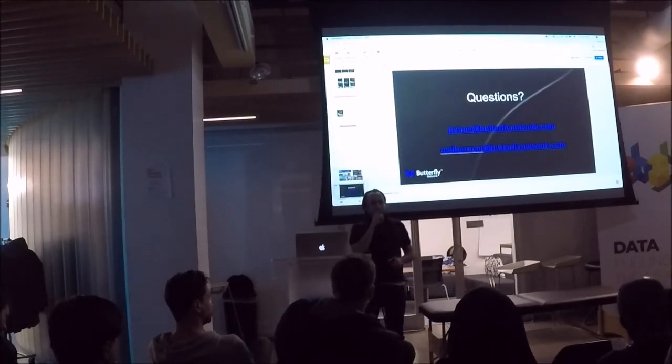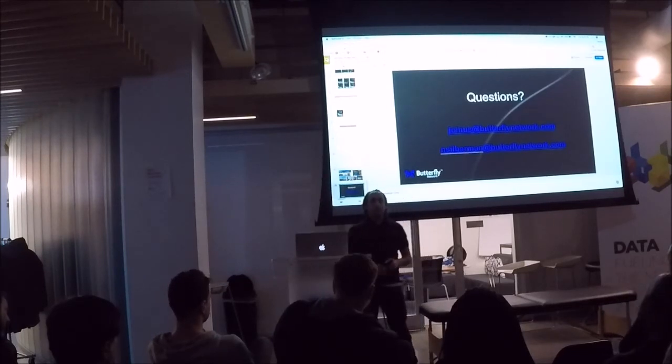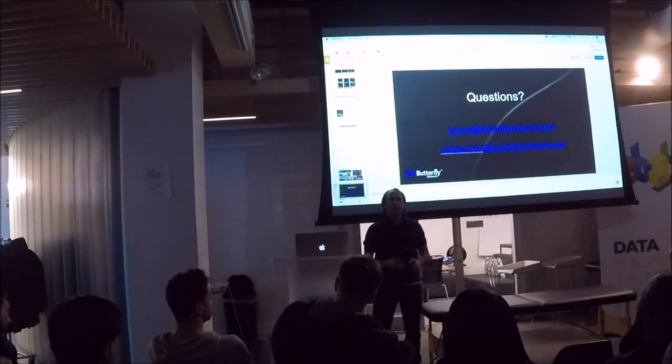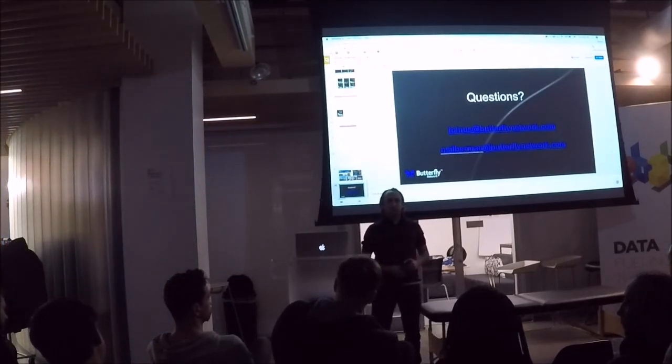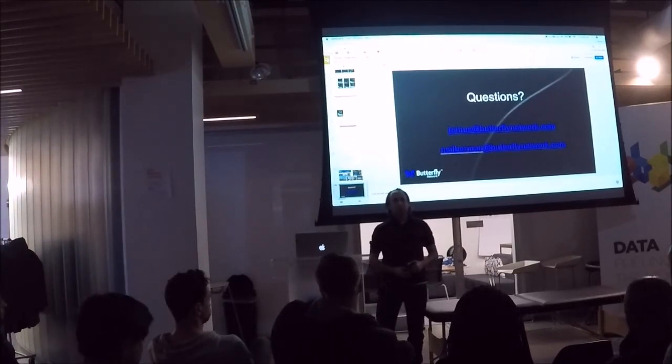In terms of your automatic measurements, where do you get the labels of, let's say, how long things are, and how does your algorithm find them in the image? Yeah, so we work with a team of sonographers and cardiologists and other clinicians, and they provide a lot of those annotations for us. So they hand draw these things on the images. Correct. Correct.